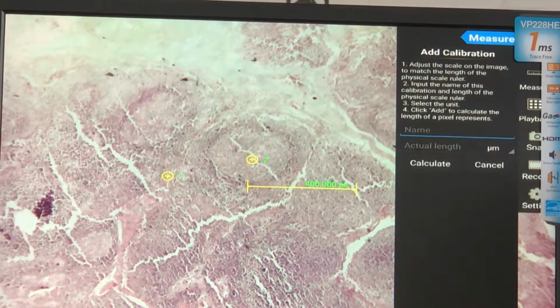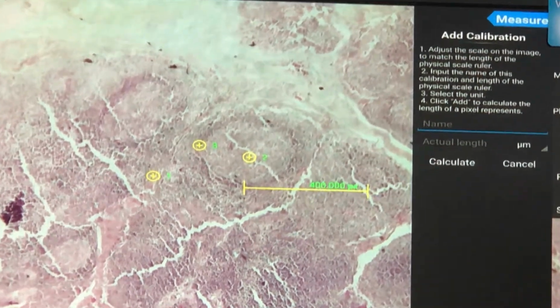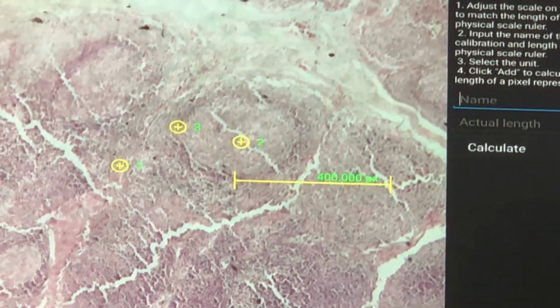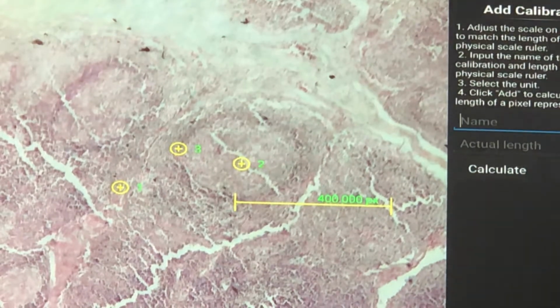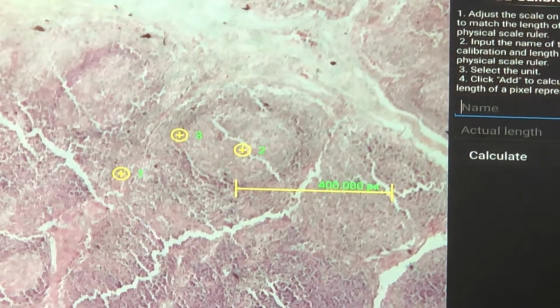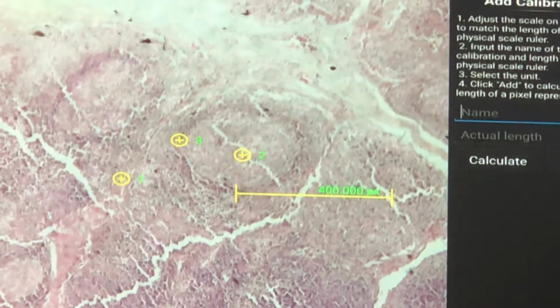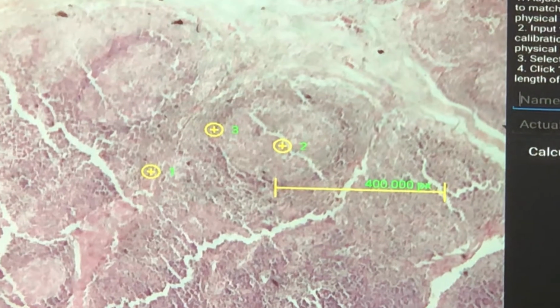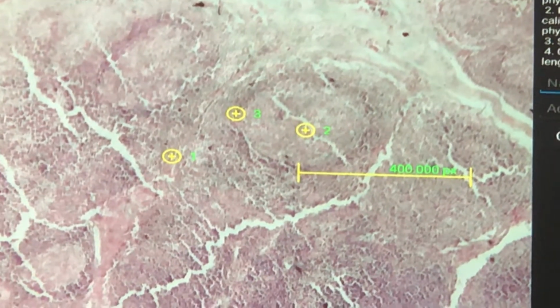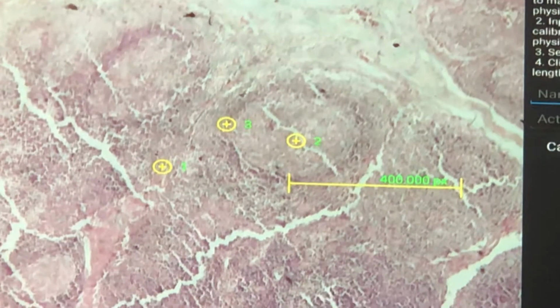This one is the follicle. This one is the lymphoid nodule. So in the lymphoid nodule, the pale area is the germinal center. So when the question says identify the anatomic structure at the tip of pointer 2, you will answer germinal center of the lymphoid follicle.